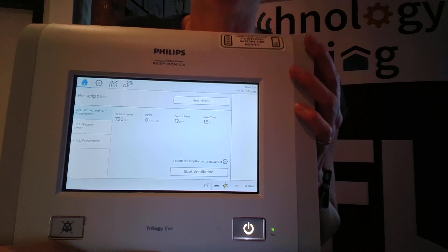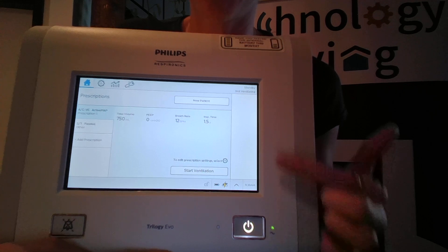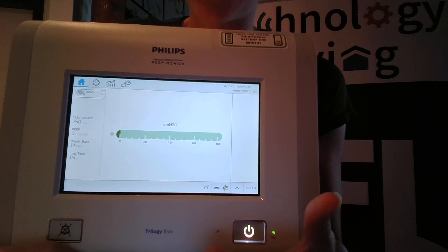This video will review how to turn on ventilation. The power button on the front will power on your whole ventilator, and then Start Ventilation will be how to start the ventilator.